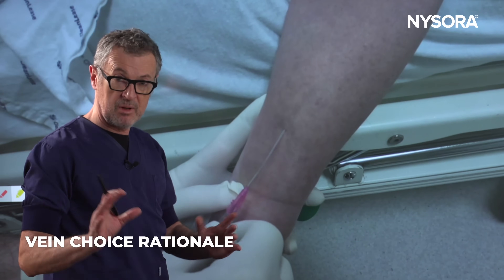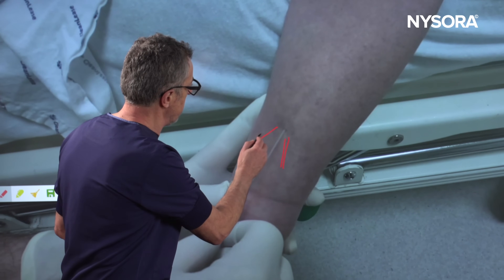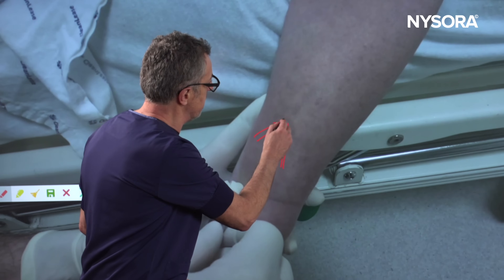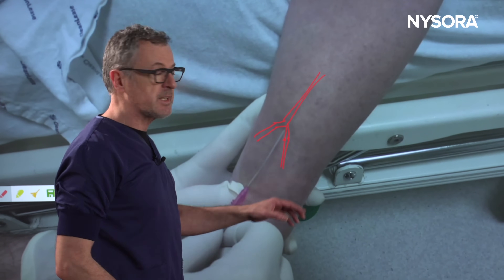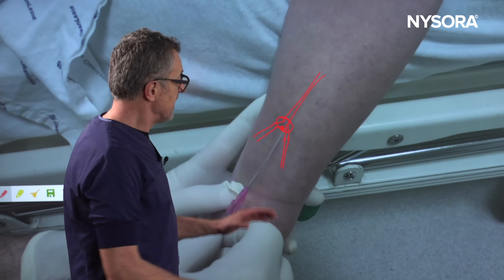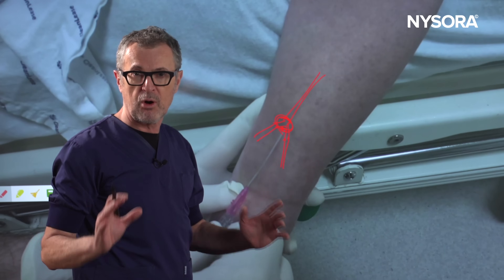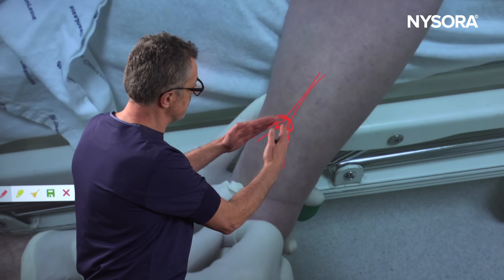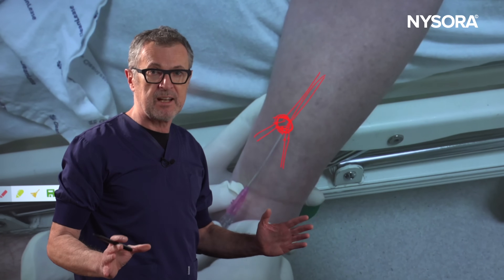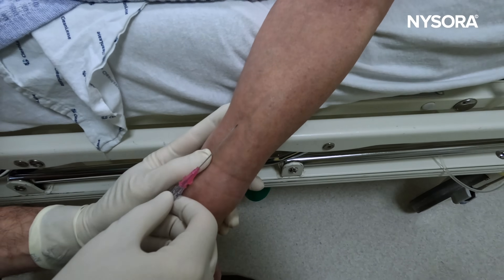So why did we choose this particular vein? There's a small contributory vein that comes from the lateral side, and another small vein that comes from the medial side. These two veins converge and give rise to a large vein that we're trying to cannulate. The fact that these two veins converge at the point where we're inserting the needle stabilizes that insertion point, preventing the vein from rolling off. That's a very important trick you should always try to reproduce — find the two veins that contribute blood to the larger vein you want to cannulate, and insert your needle exactly at that spot, because that is the least likely spot the vein will roll.